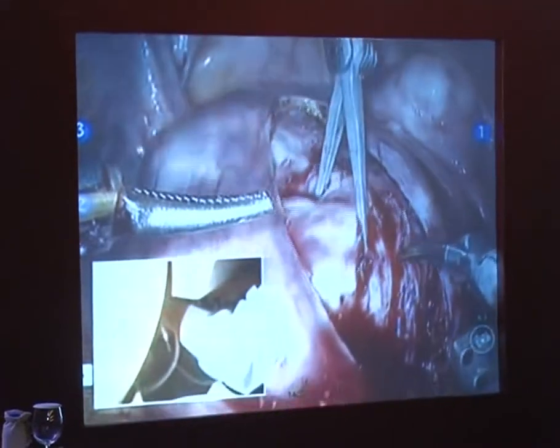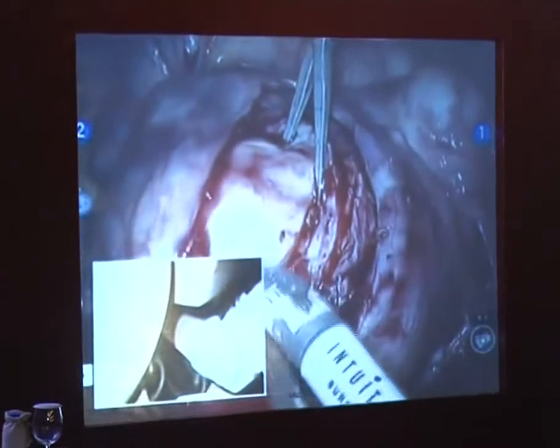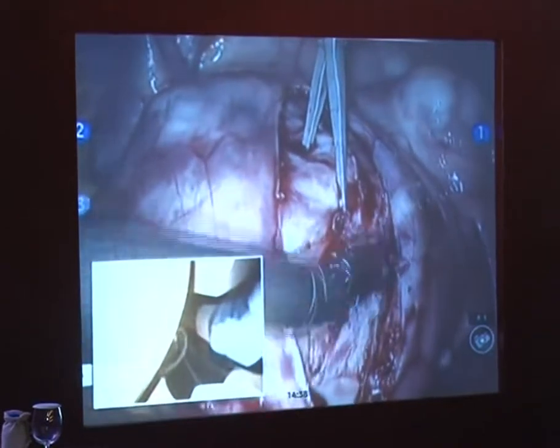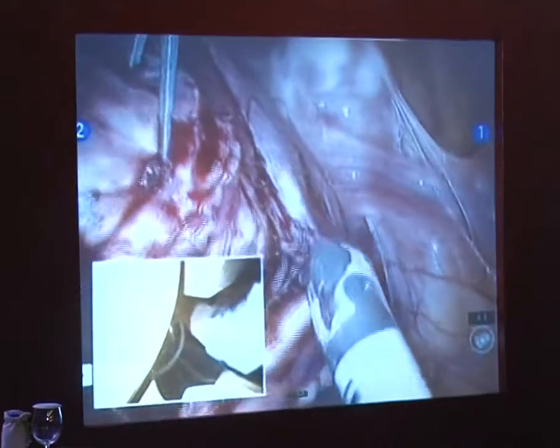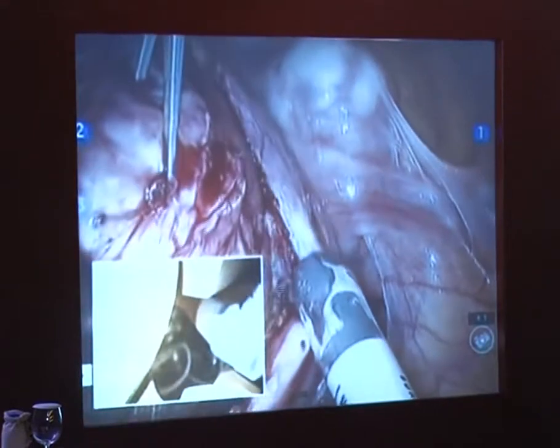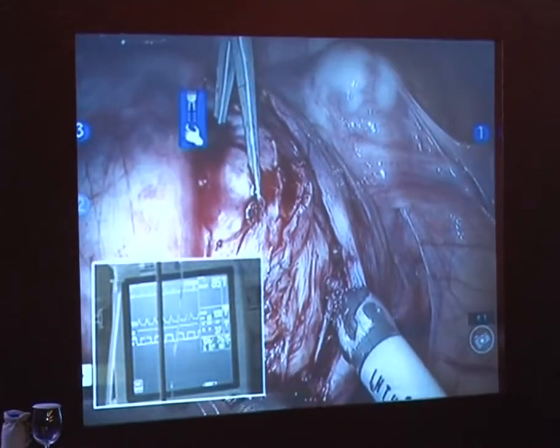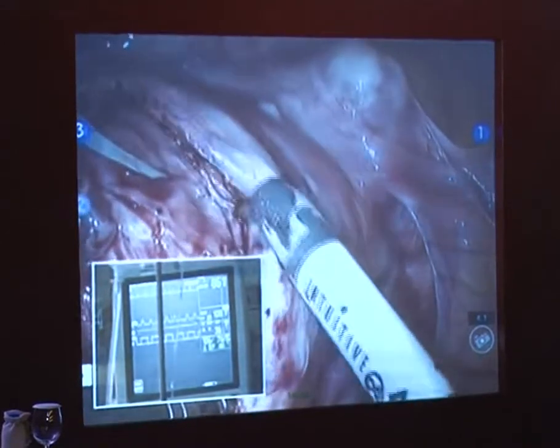The difference with robotic myomectomy compared to conventional laparoscopy is that with conventional laparoscopy, you do a lot of muscling out the fibroid, as if you're taking the cork out of a wine bottle. But with robotic myomectomy, particularly when you're not using the dual console and you're by yourself, you end up basically holding the myoma and then tracking against the static tenaculum. That's basically what we're doing here: we're holding the myoma and we're working against a very static tenaculum, right? That's what we're trying to do.